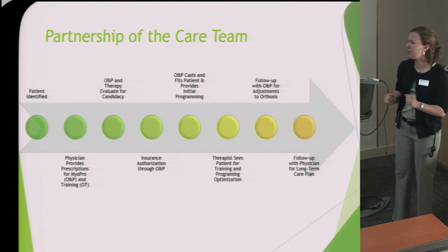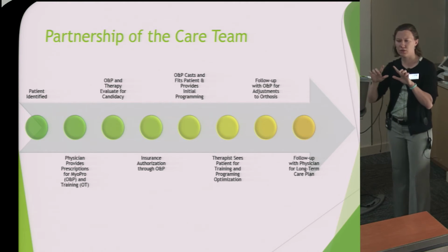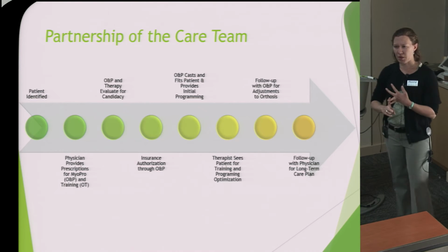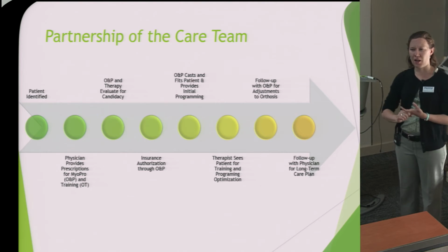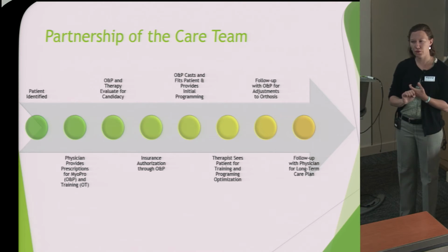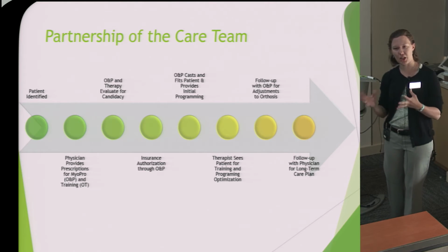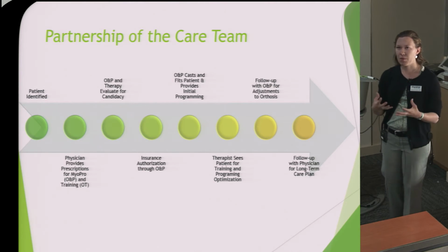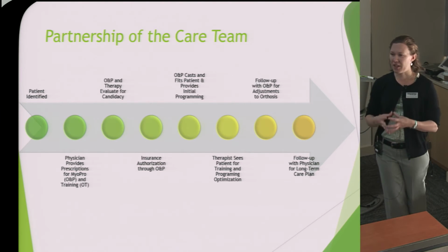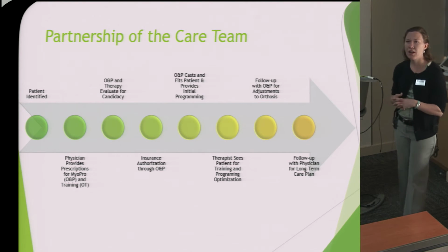So the care team itself, the trick here is really ensuring that we basically have a cooperative referrals triangle. So really what we're looking for is the physician, the O&P provider, and then an occupational therapist. The occupational therapist is really key to training the patient to make this a functional tool for them and to really help them learn how to use this so it doesn't end up being something that sits in the closet. The O&P provider is going to be the person who is actually going to check the insurance, fit the patient, ensure that the fit is correct and that things are working appropriately for that patient.